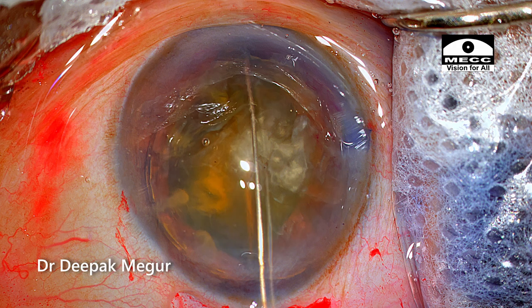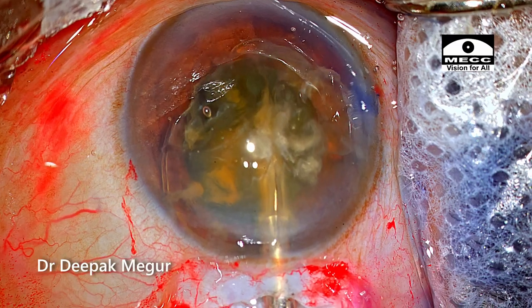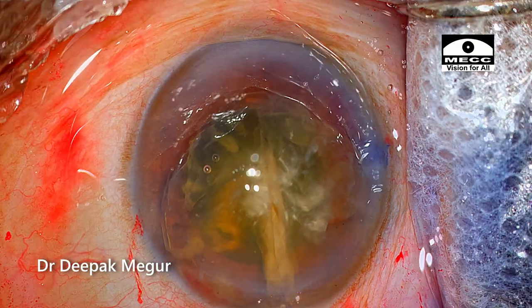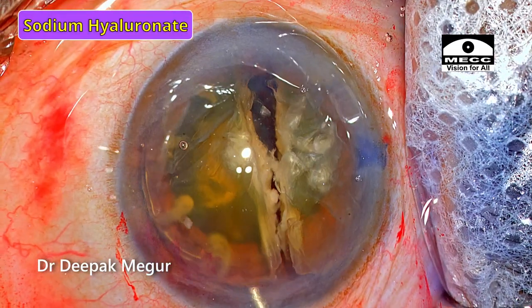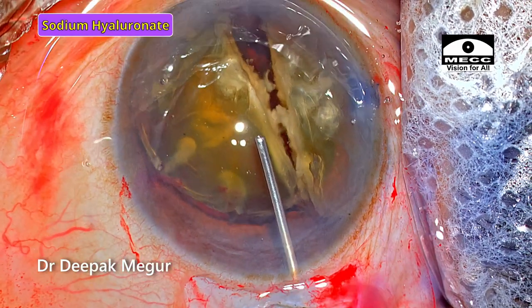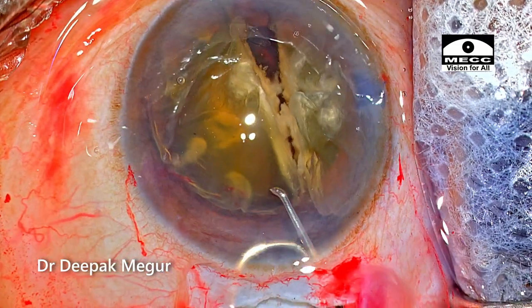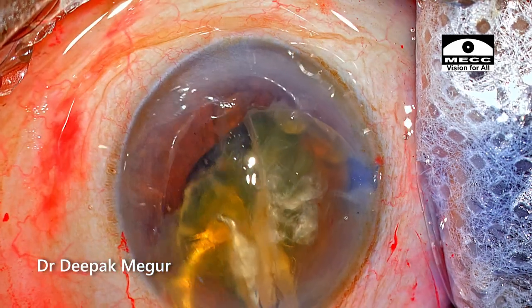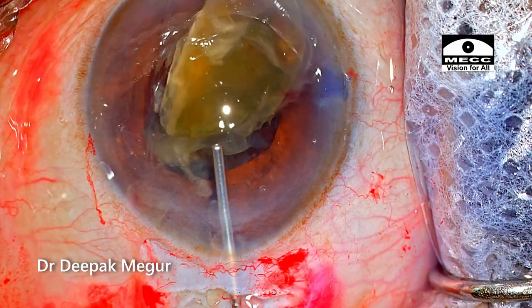Once I'm sure the positioning is correct, it's time to bisect the nucleus. The snare is pulled and the nucleus snaps into two quite effortlessly, and the chamber is again refilled with OVD. I'm using sodium hyaluronate to reform the chamber — I recommend this OVD over HPMC for those learning this technique because chamber maintenance is better. HPMC also works fine, but until you have enough experience, sodium hyaluronate is a safer option. Using a small vectis and a dialer, I extract each fragment out in the phaco sandwich technique. It's important to use a smaller vectis because a bigger one may cause the hemi-nucleus to slip into the loop.